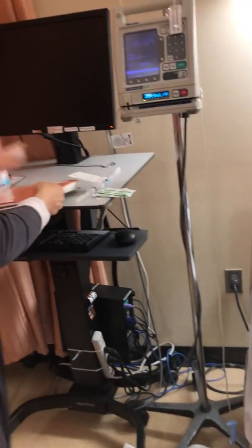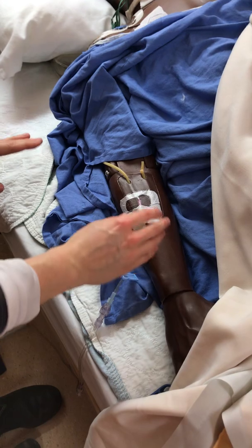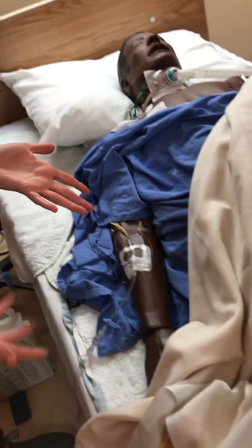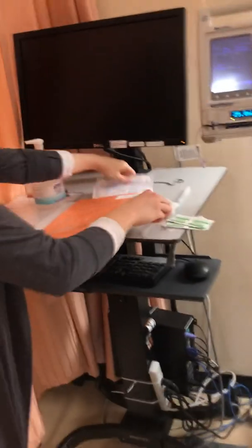At this point, while I'm down here, I will also be checking the patency of the IV. This could be a critical decision as well. I would check for swelling, edema, or anything else. I'd ask if the patient was experiencing pain. If all of that was negative, I would know it's an appropriate site to be giving medication, and that's an important step, I think. So at this point, I would do my third and final check with my medication.